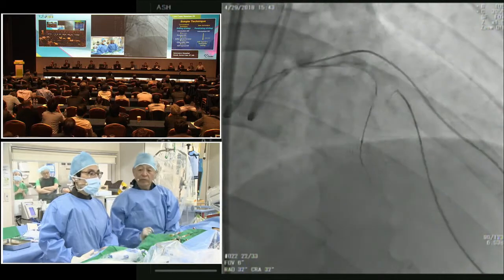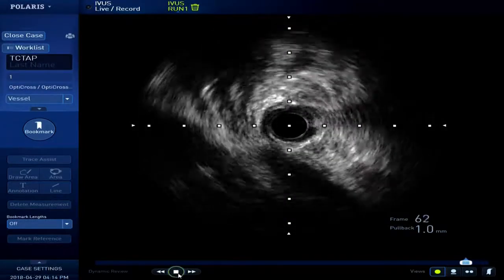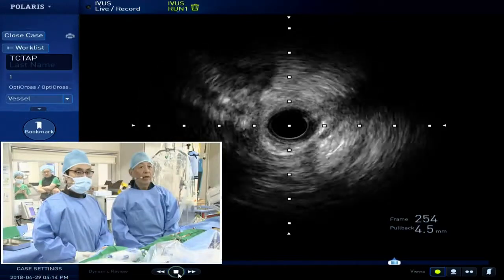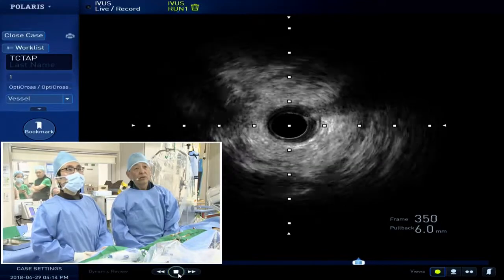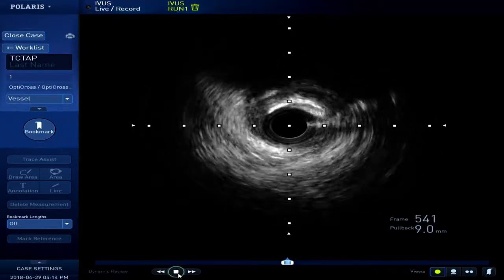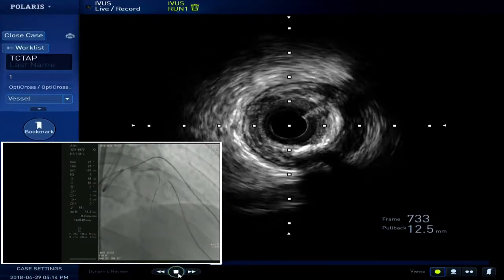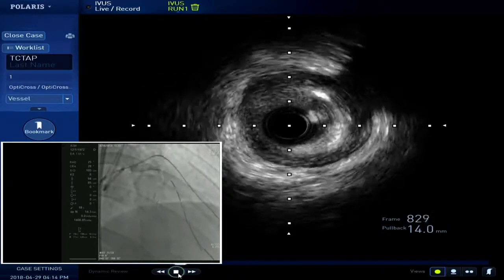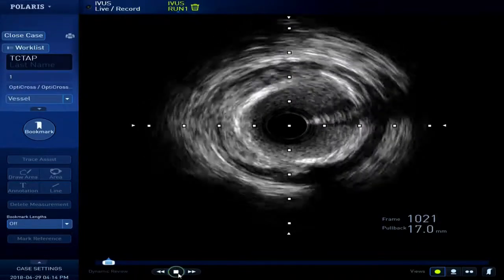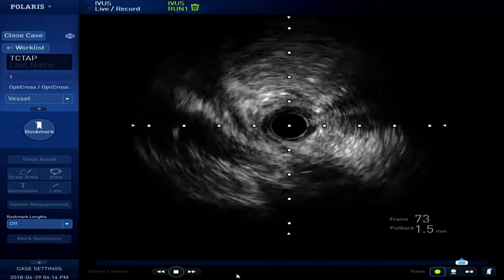All right. Please, I want to show the IVUS finding. This is the septal branch. And the LAD is coming from the 1 o'clock direction. This one. And the diagonal branch is coming like this. Okay, and the next step is, of course, puncture of the correct entry point.